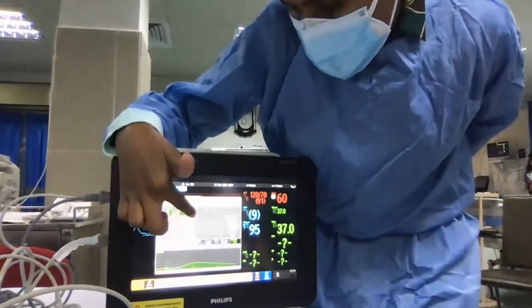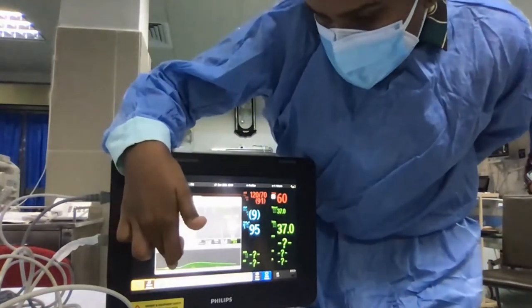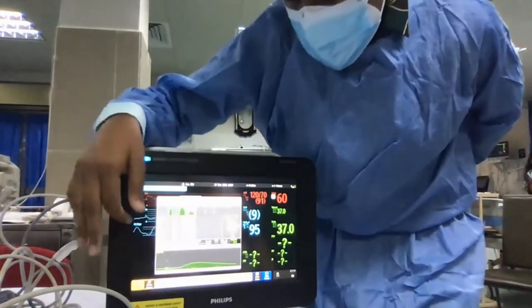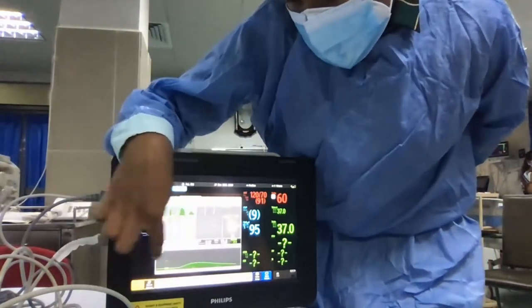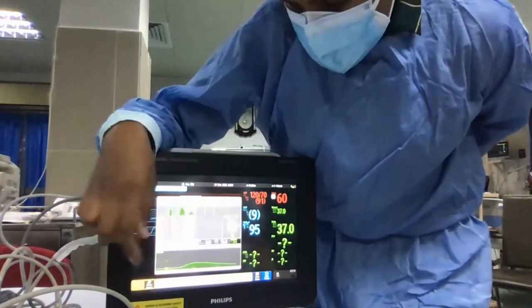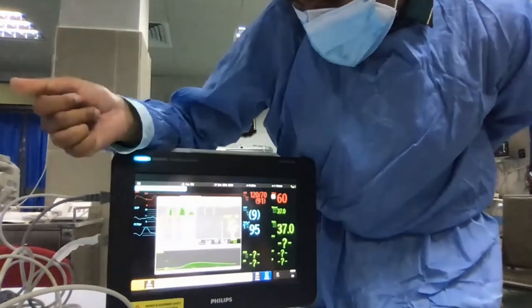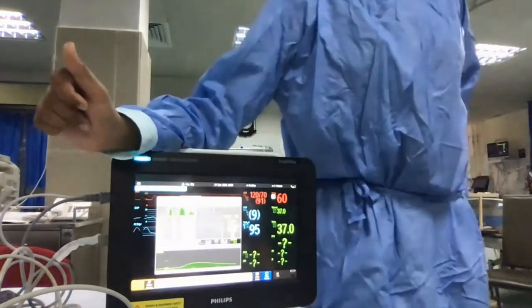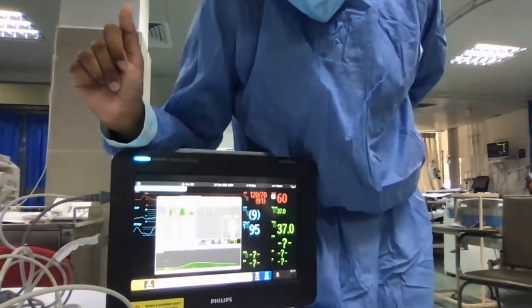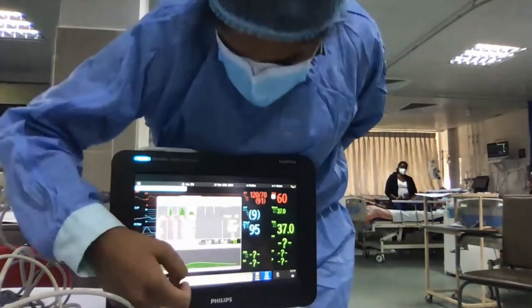Again, the cardiac output is around 11.4. Wait before starting a new measurement. Just don't push the button right away. Just wait for the ready for measurement message. I will take up to 5 measurements. Sorry, it is not an effective bolus. You can see it's very narrow, short and elongated, so it is not an effective one.